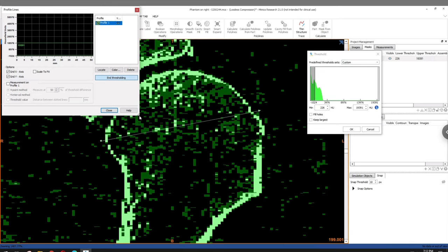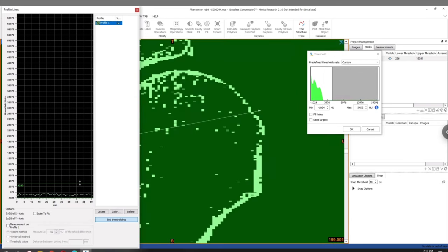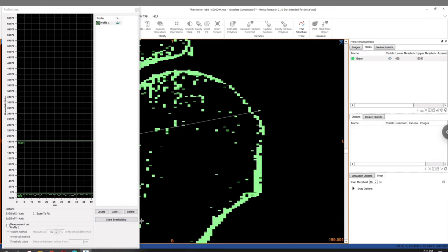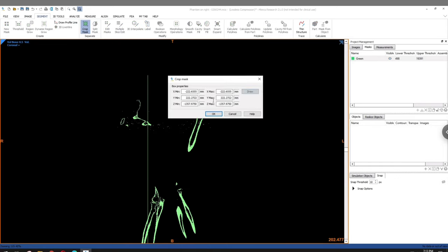As you can see here, I'm using the Mimics native profile line feature, mimicking as best I can the thresholding that I previously did, just using those basic contrast settings within Mimics. And as you can see here, it's exceptionally easy to get, if not exactly, a very similar mask as you originally did just by using those basic contrast settings.